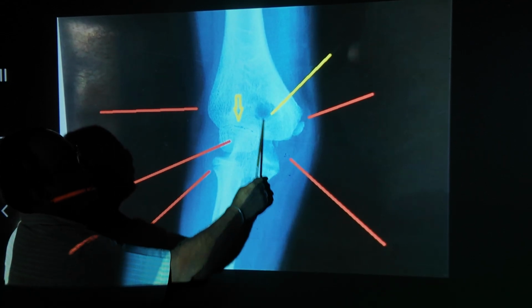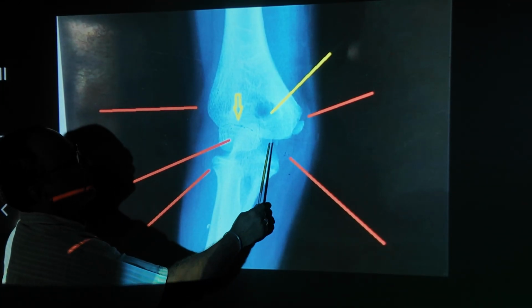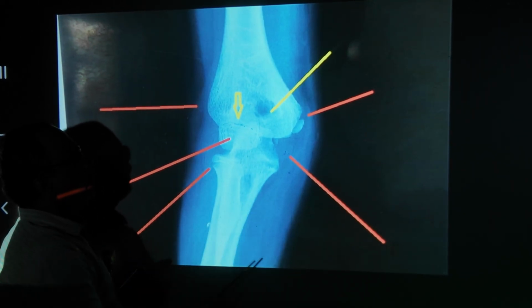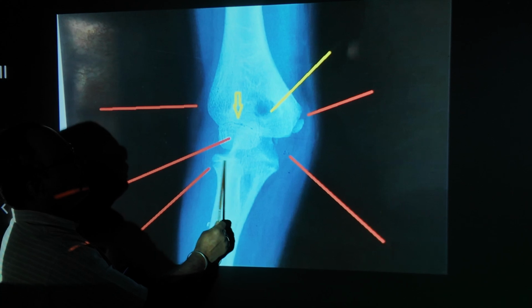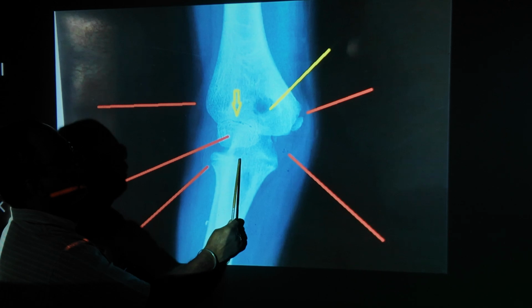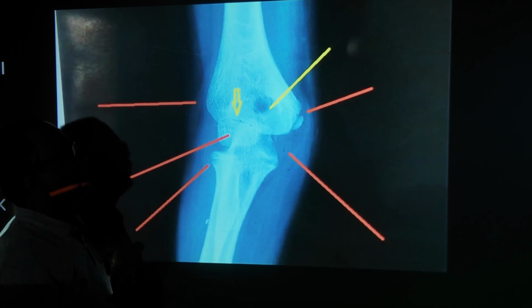Olecranon process, not appeared. It is not seen in this view. Radial head, upper end of the radius, appeared but not fused.